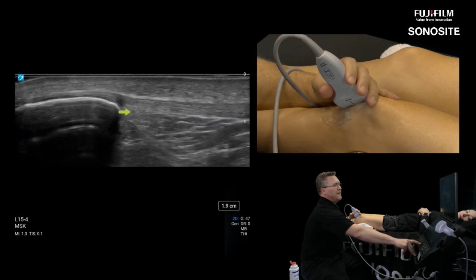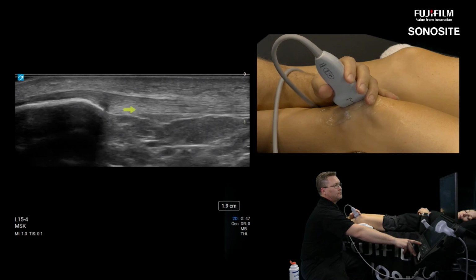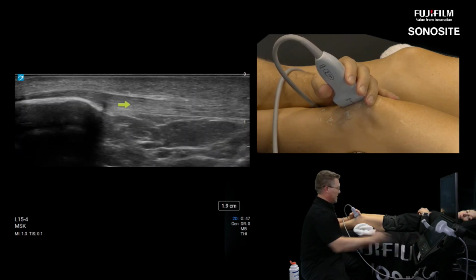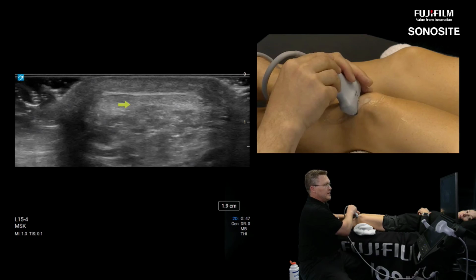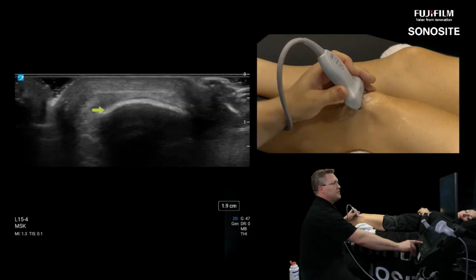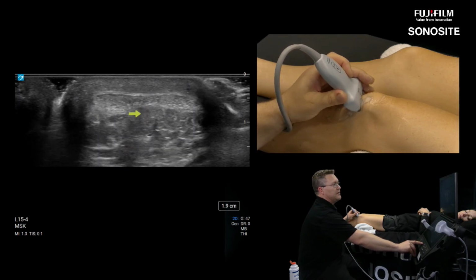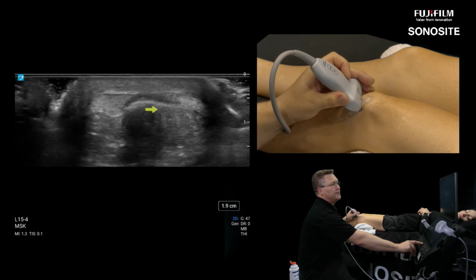So we just want to keep an eye on this area right here on the undersurface where I see a lack of fibrillar detail. And then to confirm that, we just switch over to a short axis. We cut the patellar tendon in short axis. Left side will go medial again. Start up at the patella. So here's the origin at the patella, and then I'm just going to climb off the patella towards the tibial tuberosity. And I see maybe a thinning down the middle where there might have been more tendon architecture on this undersurface. So it's just something to watch out for.